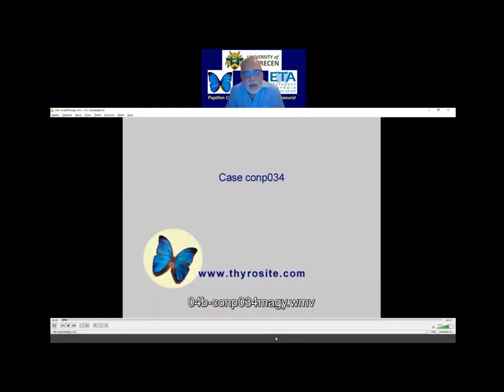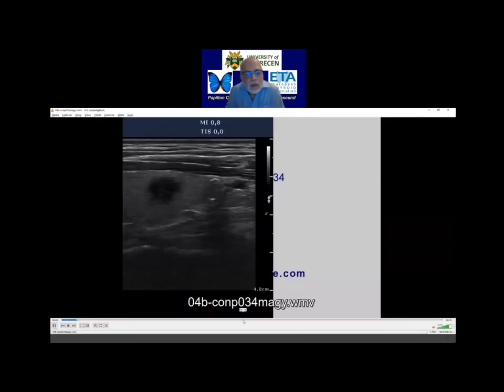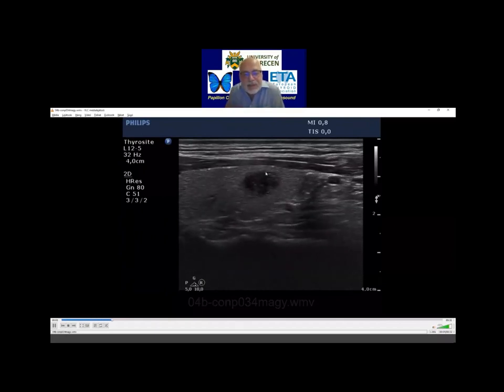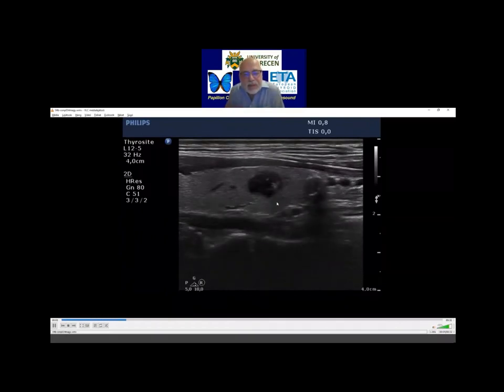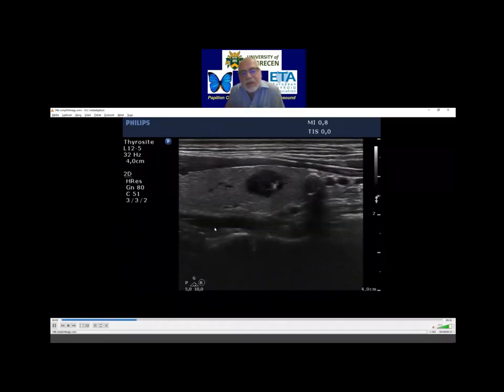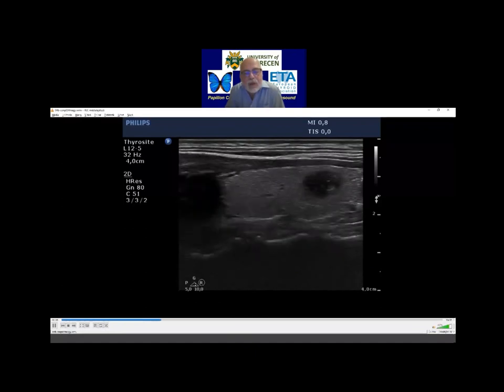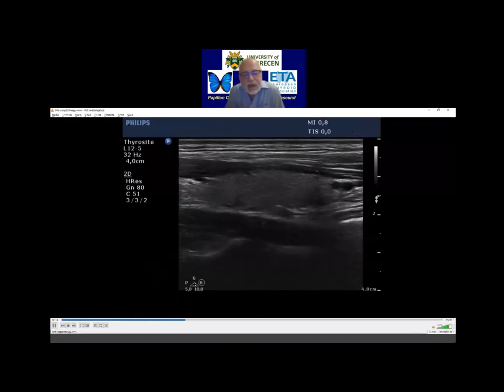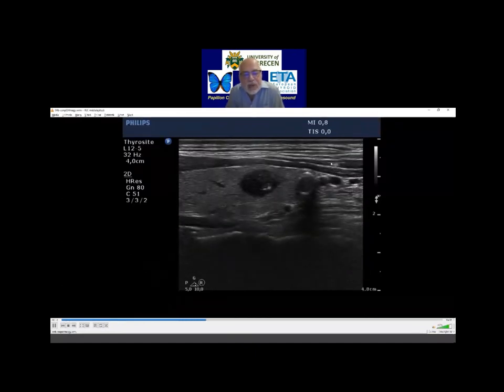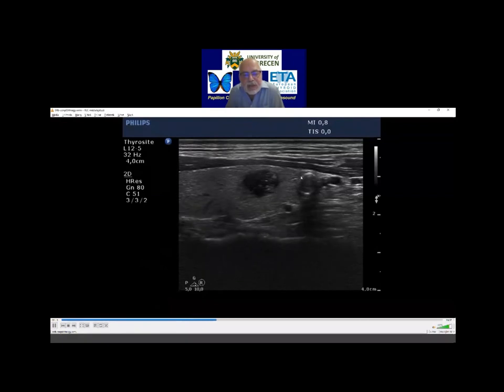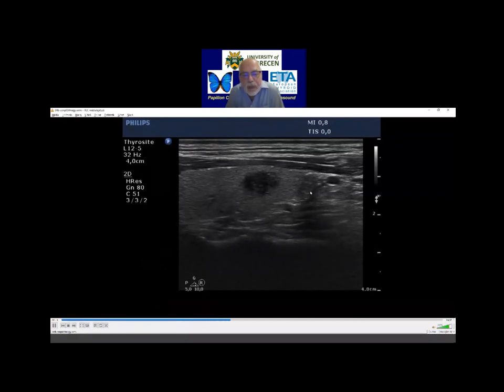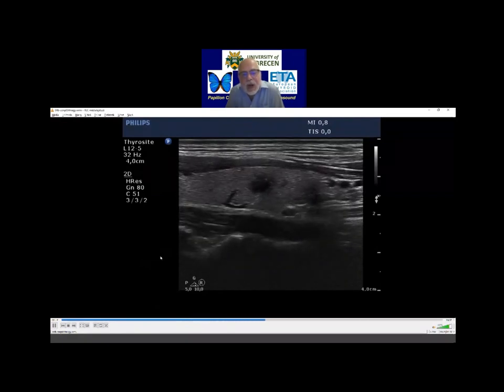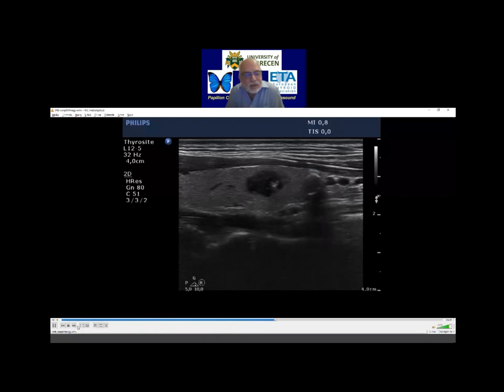This is the problematic nodule. I will tell you the final histological diagnosis: this proved to be a papillary cancer, and this one a benign hyperplastic nodule.